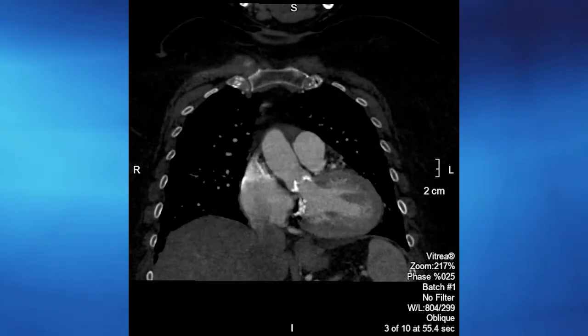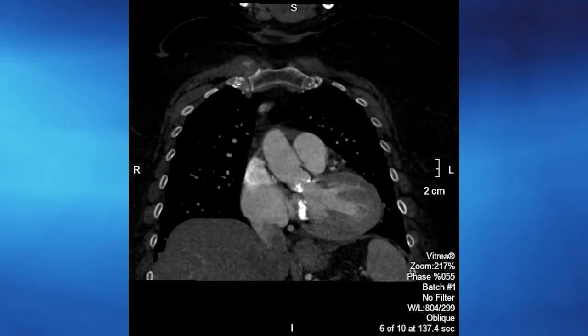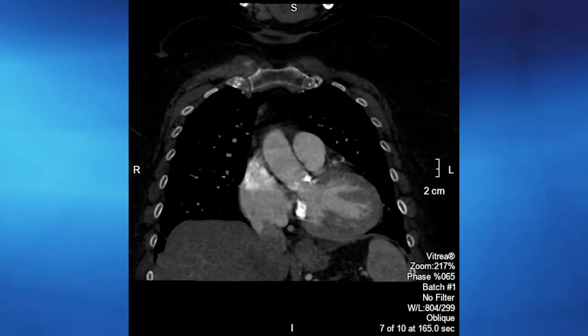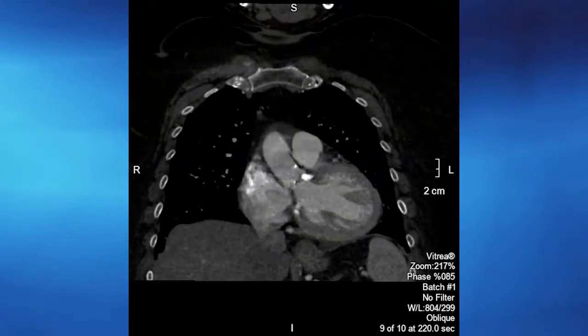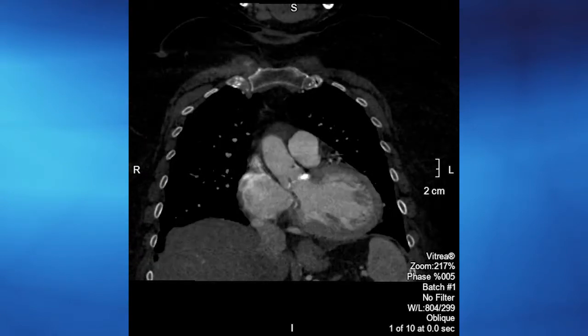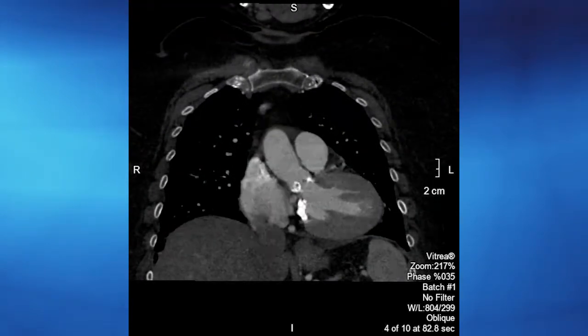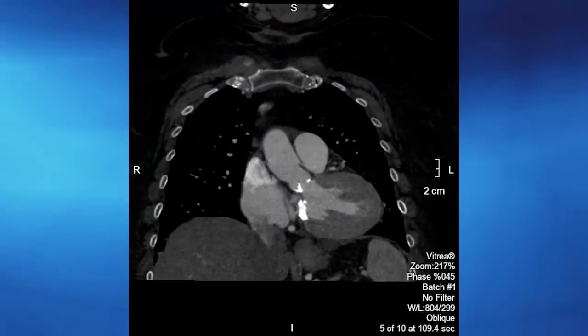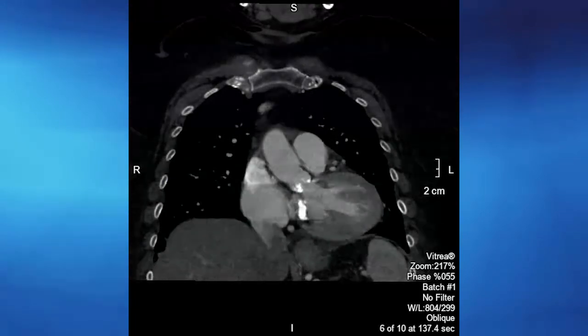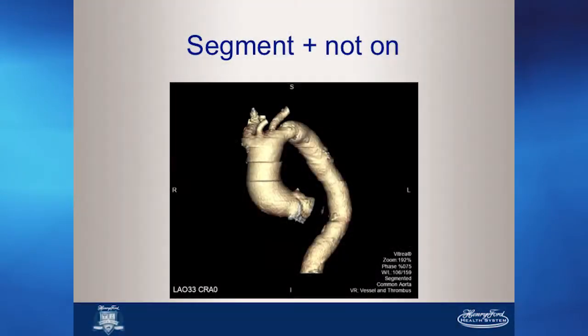So this is a breathing image. Patient breathed. You see the diaphragm moving. Not much we can do about that other than rescan the patient. This is where education comes in. This is where you really have to be very vocal in telling them, you need to hold your breath. Otherwise, we will rescan this patient. They probably got rescanned that same day, immediately. The techs have been trained to look for breathing artifacts and breathing motion, to determine if the patient needs to be rescanned or not. This is what happens when Segment Plus isn't turned on. So it's all jaggedy.